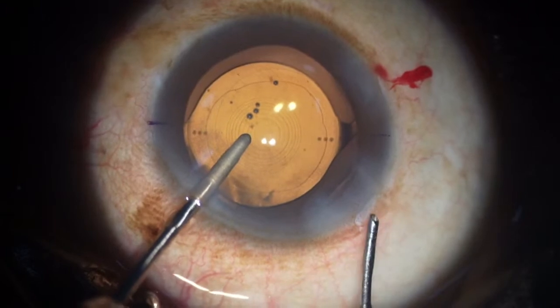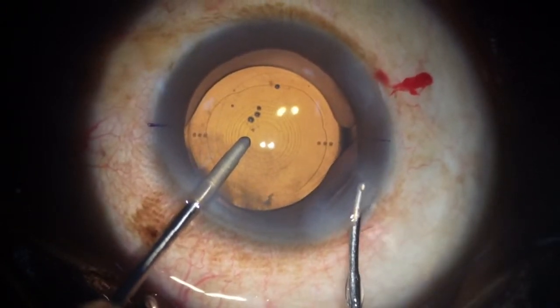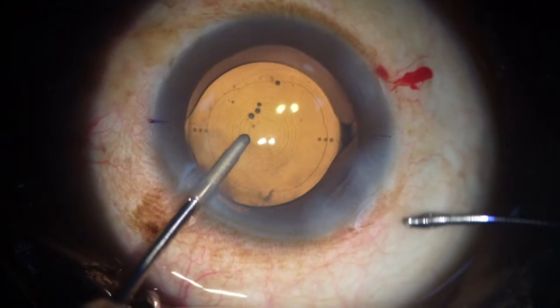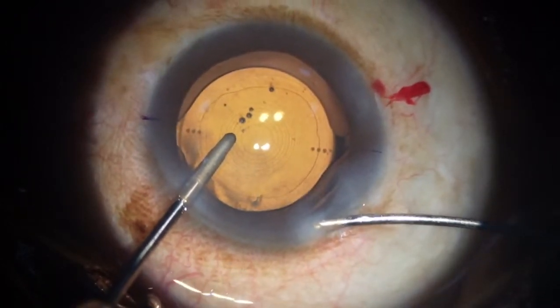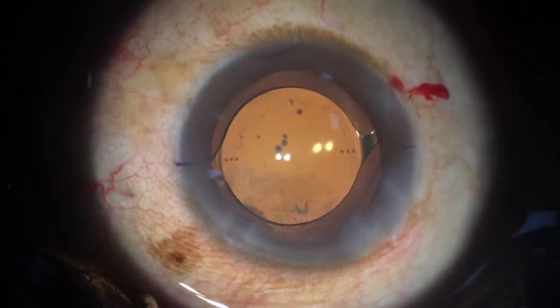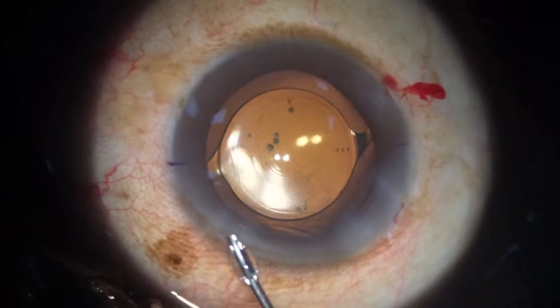I would normally implant a geometric for most of my patients, unless there are some patients who are insisting that they want better near vision. Otherwise, I'll just implant a geometric. And if after the first surgery the patient is happy, I'll go ahead with the second implant also as a geometric. But if the patient feels that he would like slightly better near vision in his second eye, I will go to the geometric plus, which gives slightly more light to the near rather than to the distance and the intermediate.